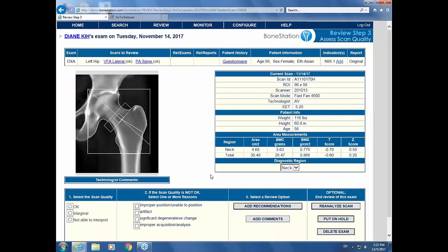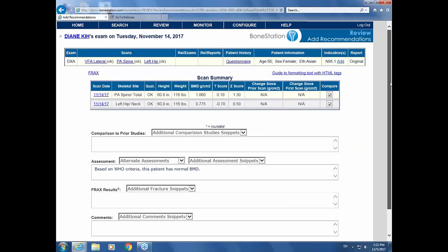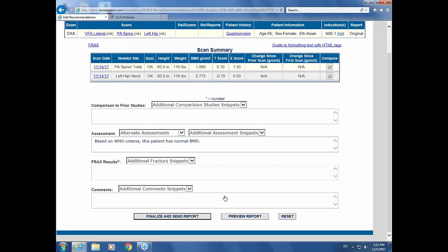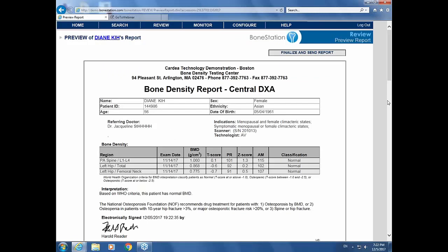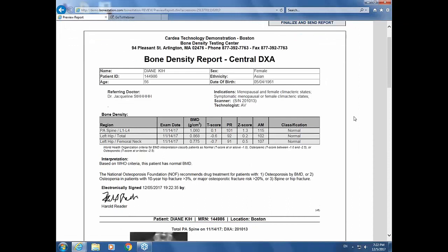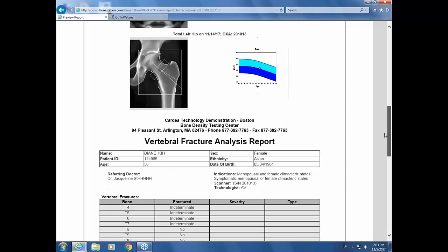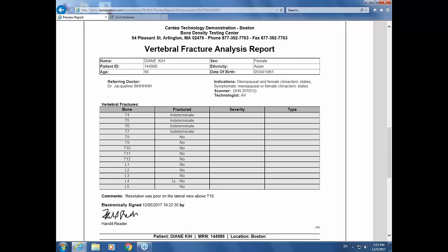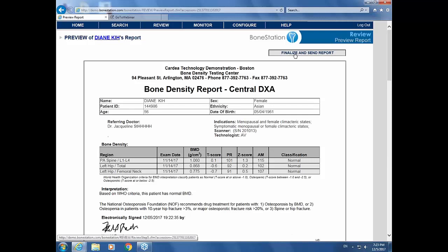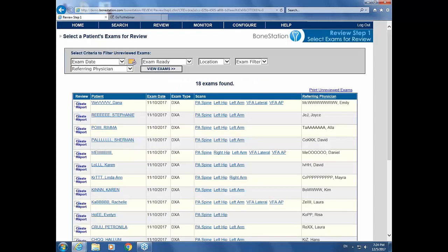The hip looks nicely done — femoral midline appropriate, femoral neck box nicely tucked against the greater trochanter, very little of the lesser trochanter showing, suggesting adequate internal rotation by the technician. We click OK and Add Recommendations. The software has read this as a normal bone density. On Preview Report we have the central DEXA report, and scrolling down we have the vertebral fracture analysis report noting we couldn't see much above T8 and resolution was poor on the lateral above T10. We have essentially two separate reports melded as one, and we finalize and send.